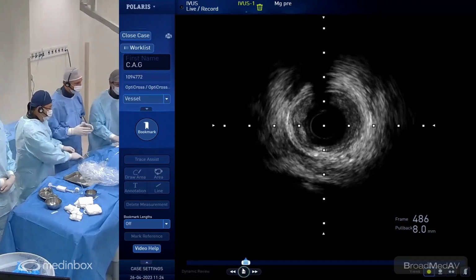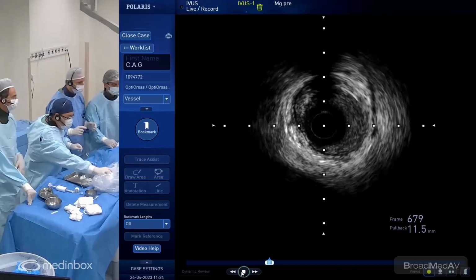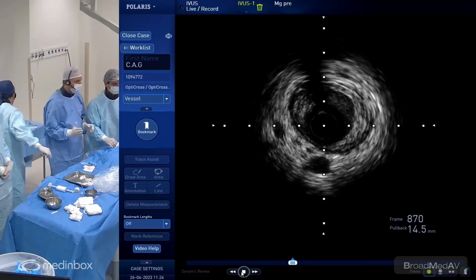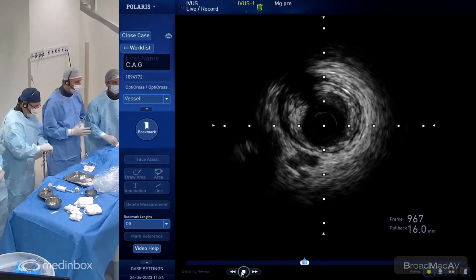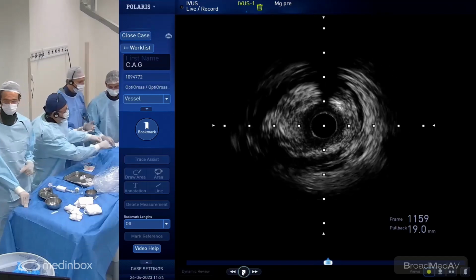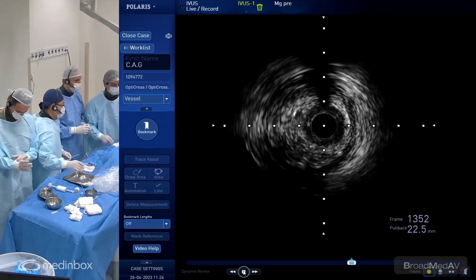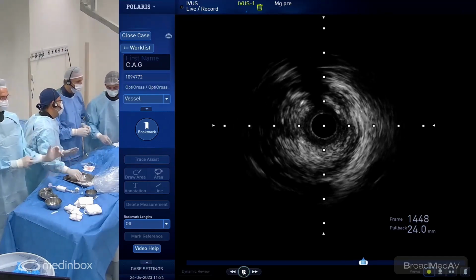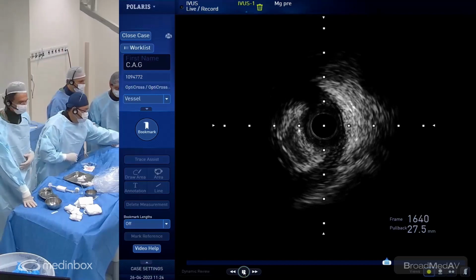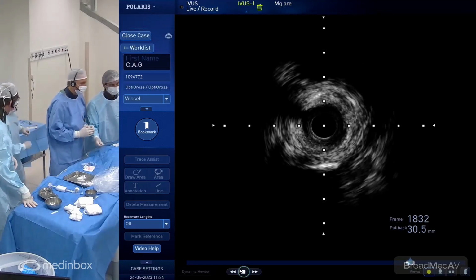We are going to measure the extension here. You might have some myocardial bridging here in the mid portion. But then, as you come, it's a large plaque burden. The vessel is 3.5, but it's diffusely diseased, as expected. More fibrotic tissue as we move towards the proximal part. This is probably a small septal. We see some degree of calcification as well. Here it's more fibrotic, but in the very ostium, that's where it gets more eccentric and calcified. A little bit of calcification here. You see the shadow here.